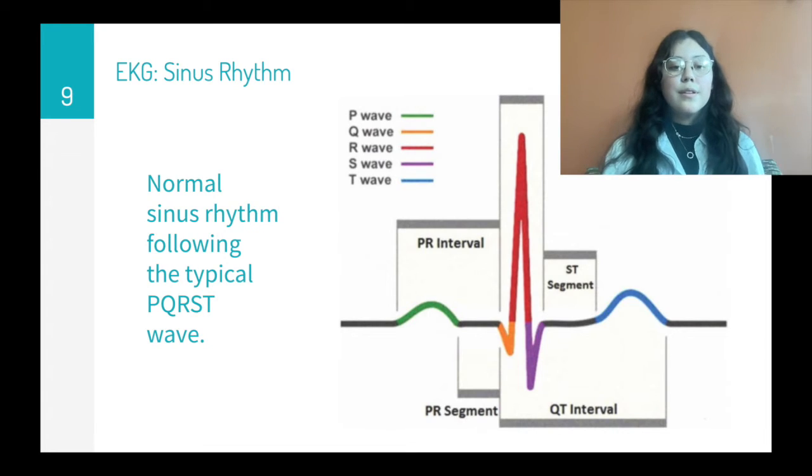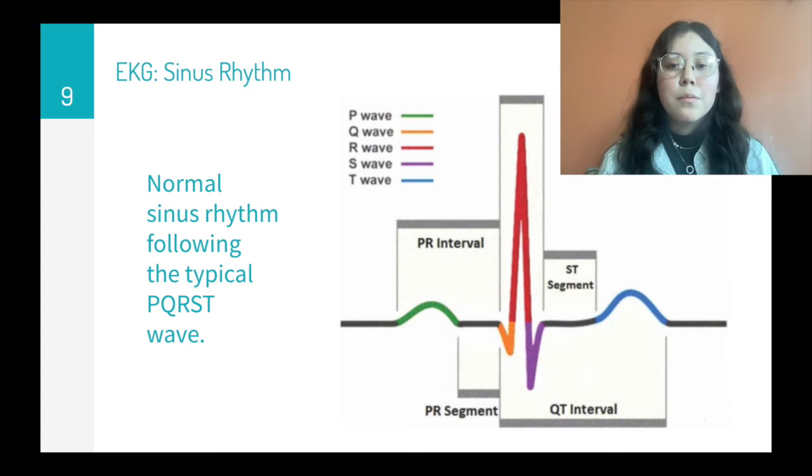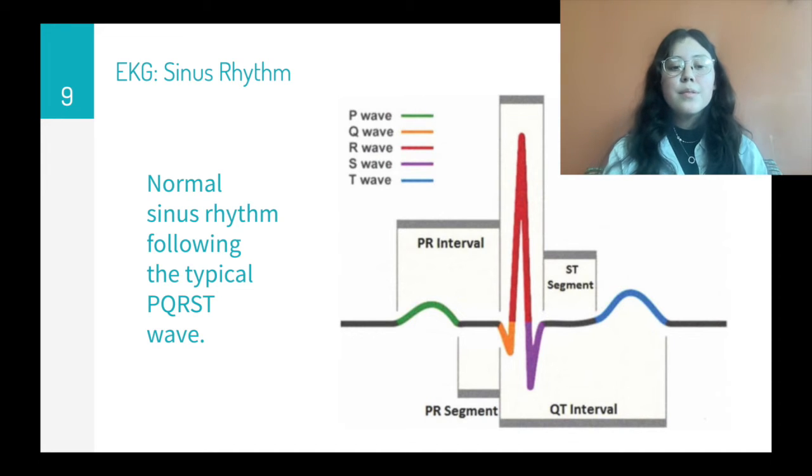Moving on. Now, it's important to know the time frame and basics for an EKG strip because it will greatly assist you in reading different types of rhythms. I've been reading EKG strips for the past 6 months, and I feel like I am qualified to share this with you. So moving on, we have normal sinus rhythms. On this screen, I provided a normal EKG portrayal of a sinus rhythm, which is what everybody has when they are healthy and their heart is in good shape.